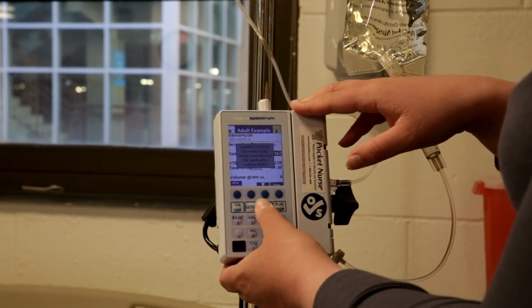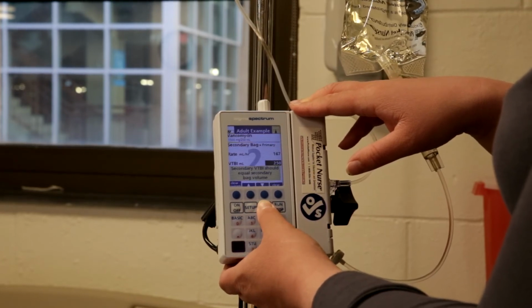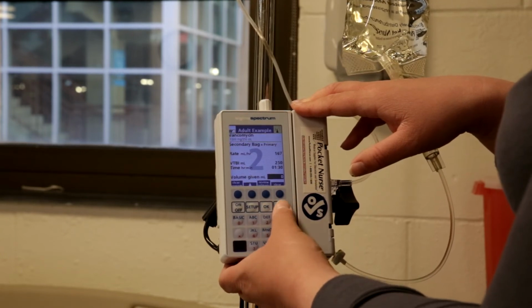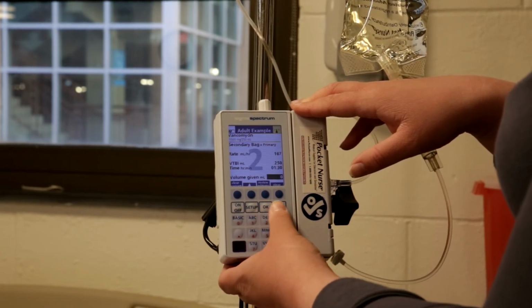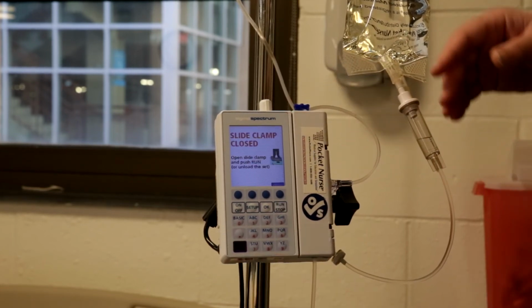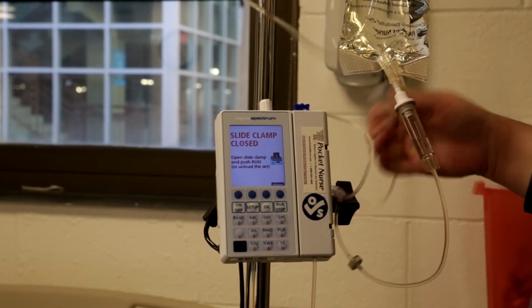This is when, so it's an IV piggyback. We're going to hit okay. Okay. And then we're going to hit run. And then we're going to check to make sure that it's still in there, the blue thing.